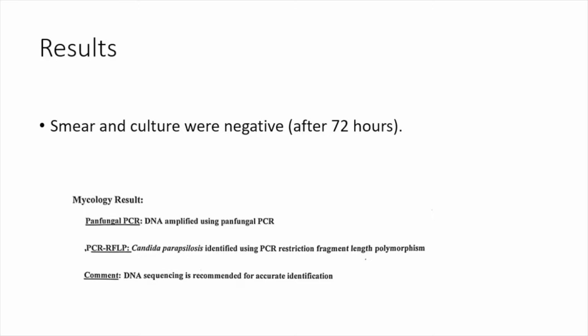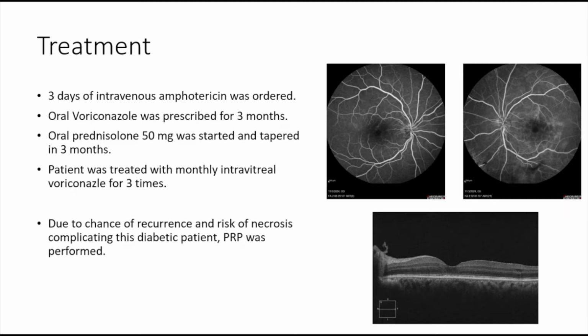Although smear and culture are negative, PCR returns positive for Candida spp, and the patient is treated with intravenous and prolonged oral antifungal therapy for at least 3 months, achieving significant visual recovery.